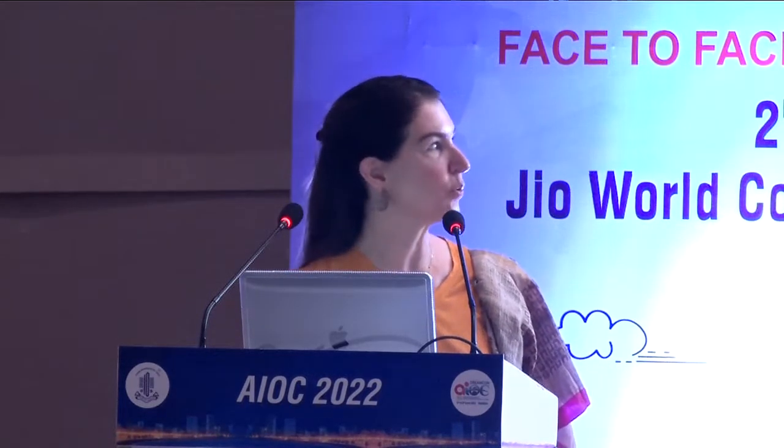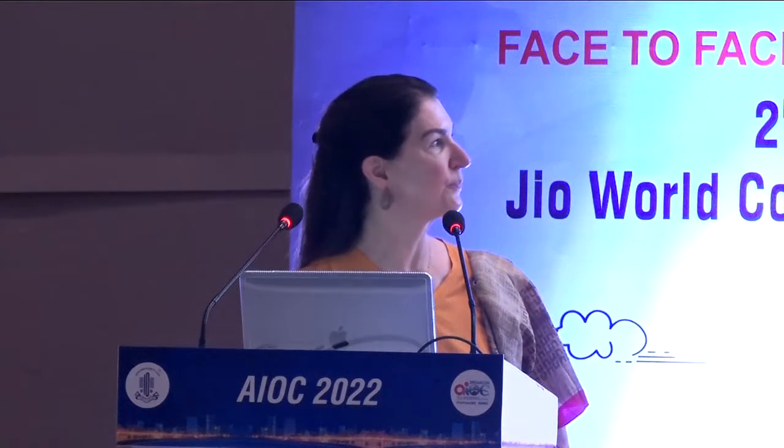Cases that are more appropriate for DSEK would include patients who have large iridectomies, aphakia, glaucoma shunts, or presence of an ACIOL. DMEK requires a good view. So to make life easier for yourself and your patient, if you have a good view, then a DMEK is a really nice option. DSEK you're able to do with a really cloudy view. I look at a DSEK as basically a slam dunk in a lot of these complex cases.